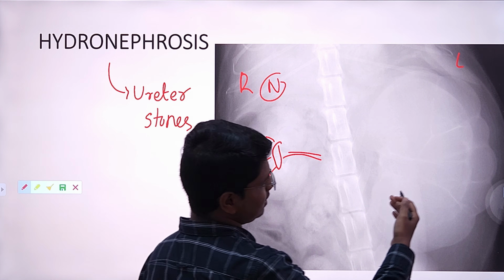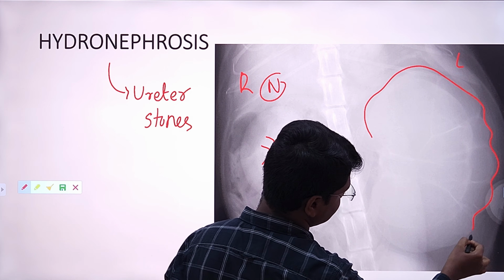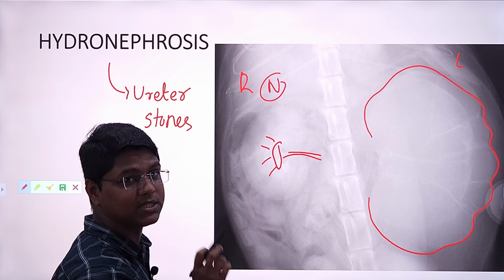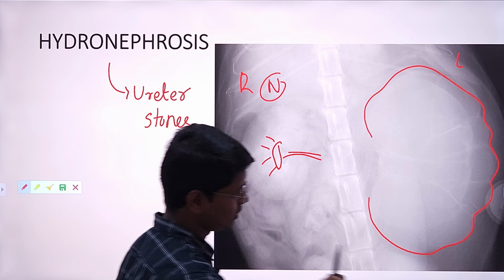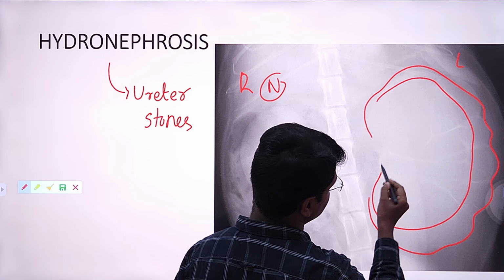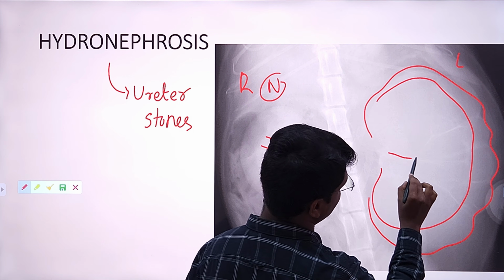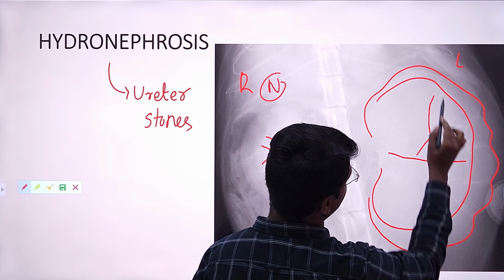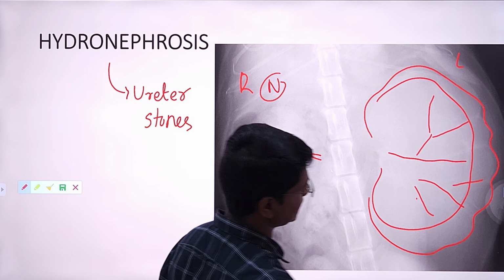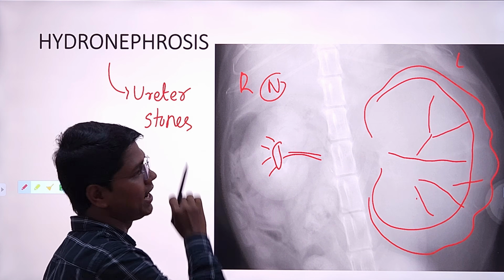But here you see the kidney is, first of all, enlarged and the border, the renal capsule, is undulating, or you can say irregular, which you may say could be a case of renal cyst. But notice other things. See the pelvis. This is the entire renal pelvis. There is a very thin cortex, and also notice the interlobar vessels, which are radiating like spokes. In bikes we have spokes, so radiating like spokes. These are characteristics of hydronephrosis.